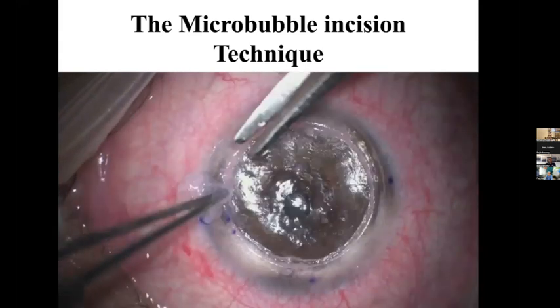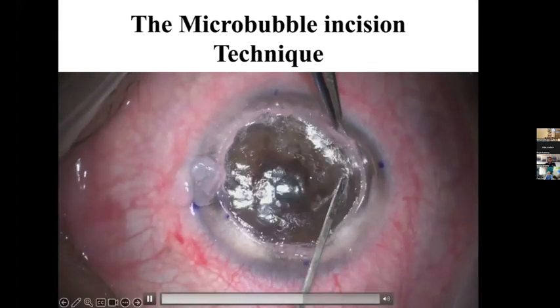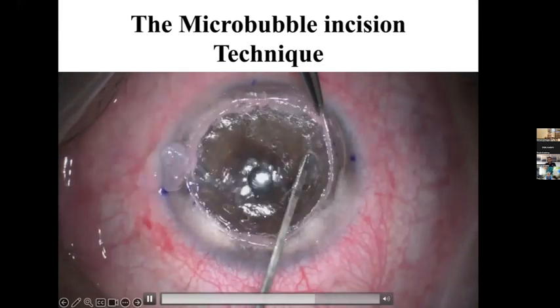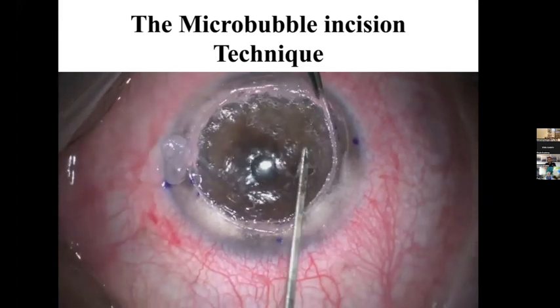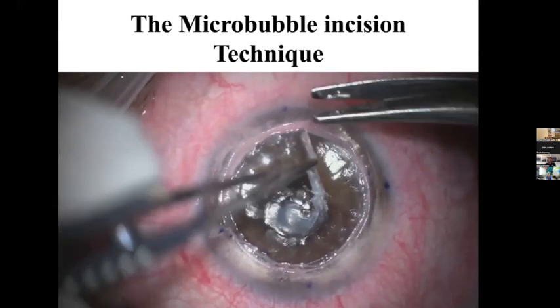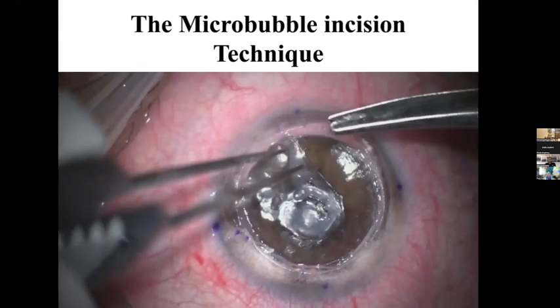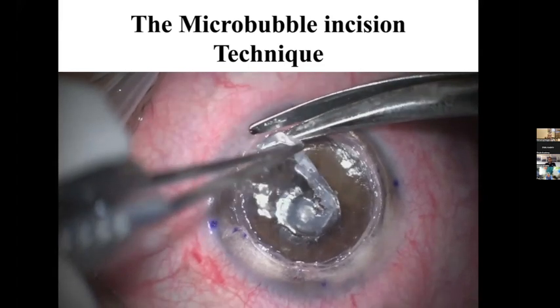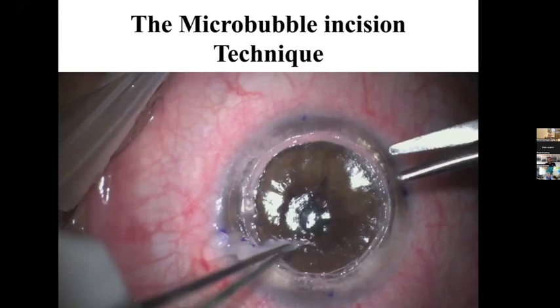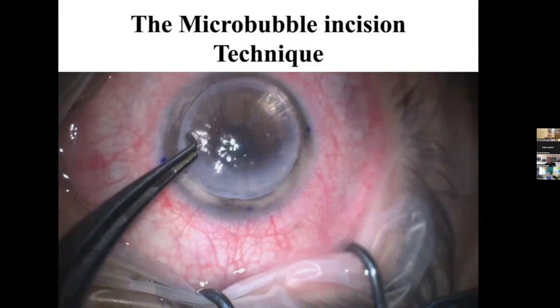After removing the stroma, I inspected the bed and found that still there are microbubbles present. So this is indicating that still a significant layer of the stroma is present, necessitating the repeating of the process until you reach a plane where the residual part of the stroma is devoid of microbubbles. And this is the end plane where then you can put your graft.